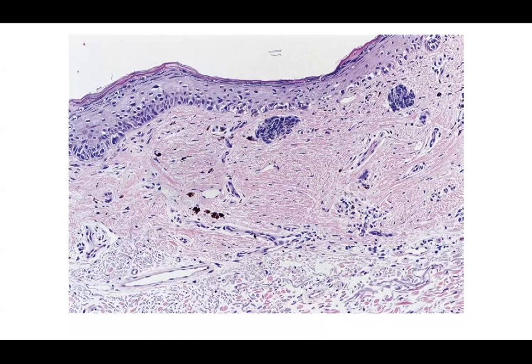You can also see these vertical vessels here, which looks to be like a scar type formation. And so maybe this lesion underwent some type of regression phenomenon, resulting in some fibrosis around the area. And then you have some invasion subsequently of atypical melanoma cells.